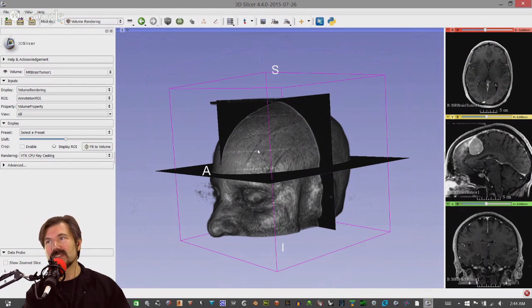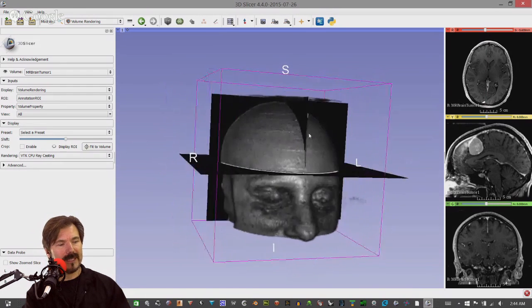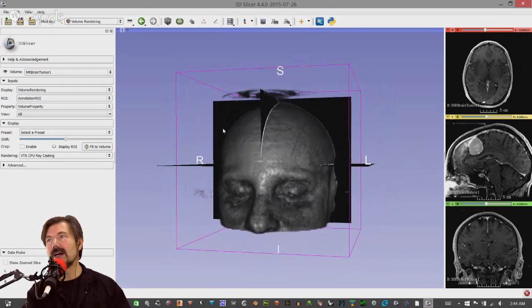So it has other things besides just medical. They use them for inspections because it can penetrate and view things internally. So if you're wondering, yes, you could scan yourself and make a model out of it. It would be expensive. There are other alternatives. But we want to do something else. We want to be able to look inside.